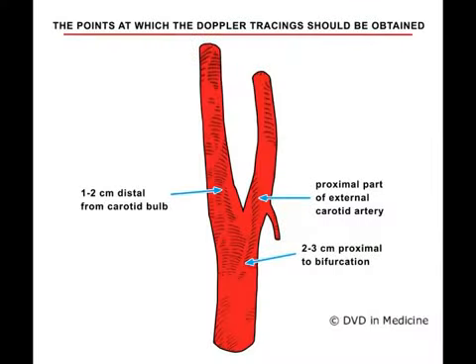In this picture, one can see the places where the Doppler velocity measurements should be taken for the protocol.